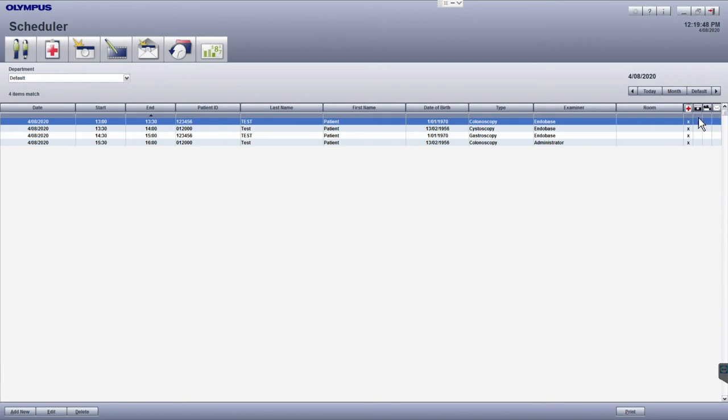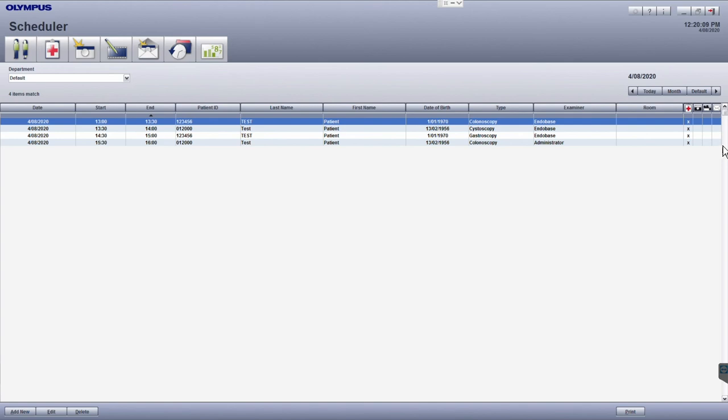Under the camera icon that tells you the number of images acquired for this particular examination. The video camera column tells you whether there was any video captured and the envelope shows whether a report has been created for this examination. As you progress through your list you will see these different indicators being populated.